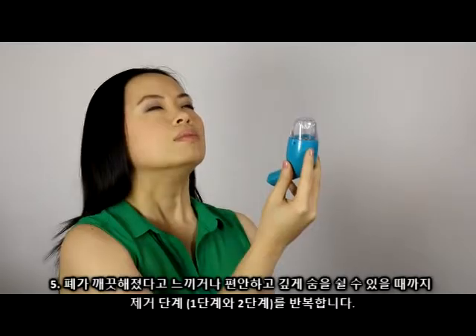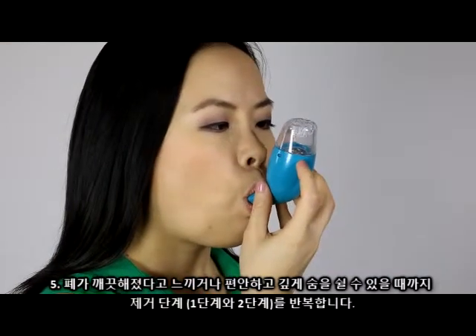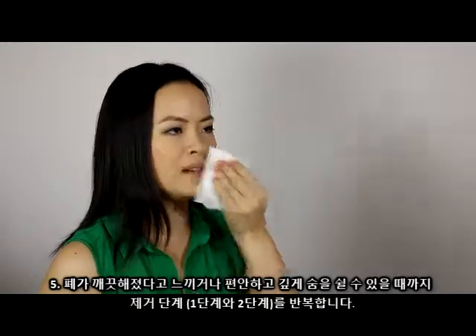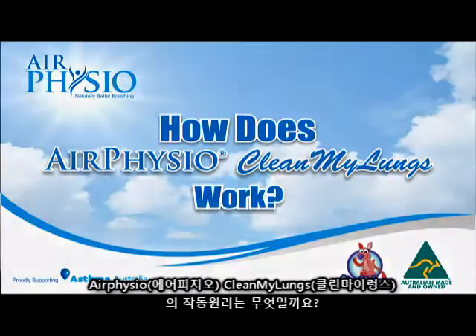Step 5: Repeat the elimination sequences until your lungs feel clear or you breathe easier and deeply. Step 6: How does Air Physio Clean My Lungs work?